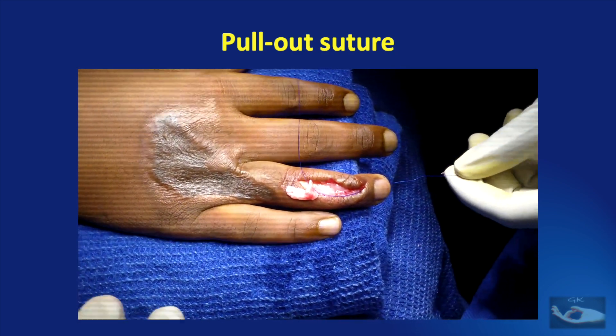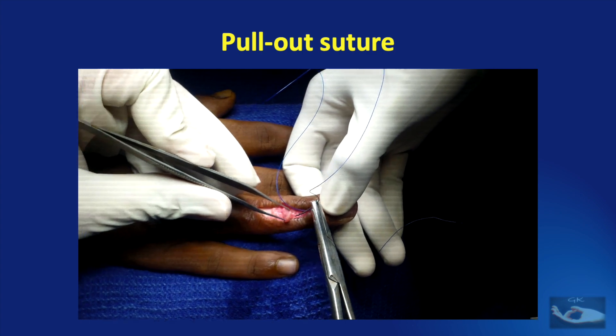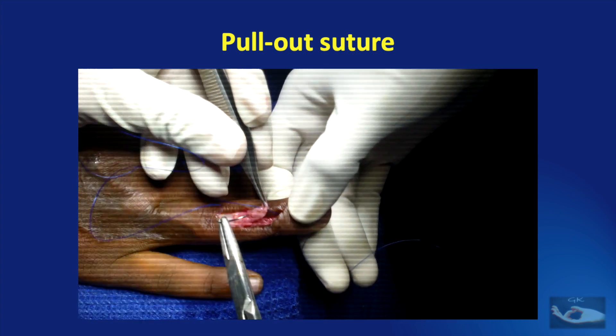With the needle end, a bite is taken through the free distal end of the avulsed extensor tendon in the form of a horizontal mattress suture.